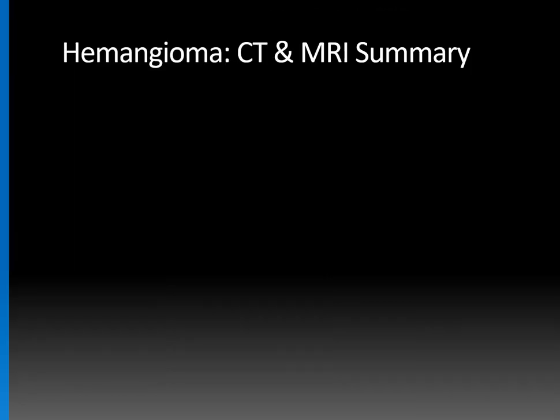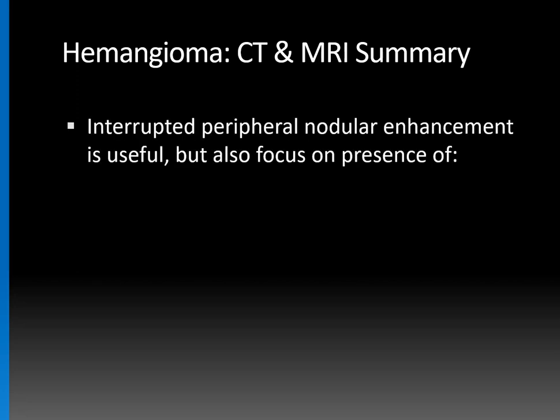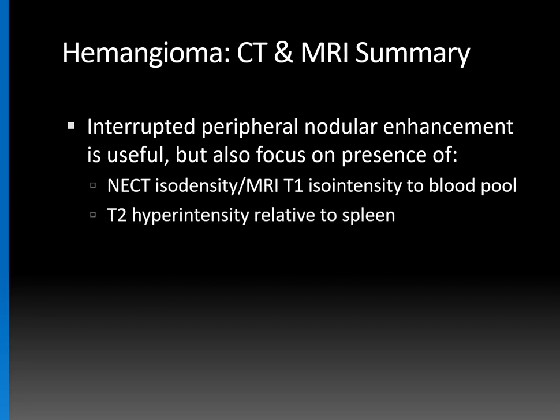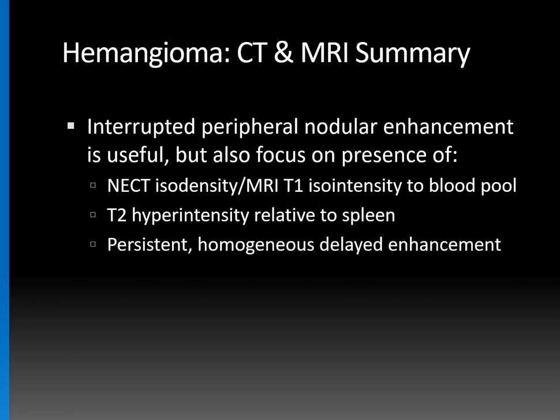To summarize the appearance of hemangioma on CT and MRI: the interrupted peripheral nodular enhancement pattern is extremely useful, but you should also focus on the non-contrast isodensity to blood pool on CT, non-contrast MRI T1 isointensity to blood pool, T2 hyperintensity relative to the spleen — a key feature — and persistent homogeneous enhancement on delayed phase imaging.